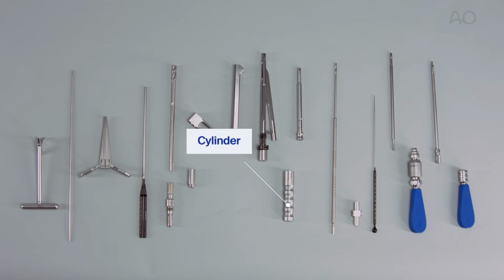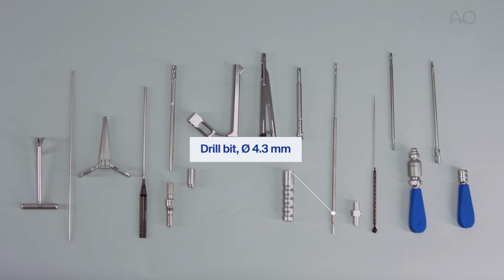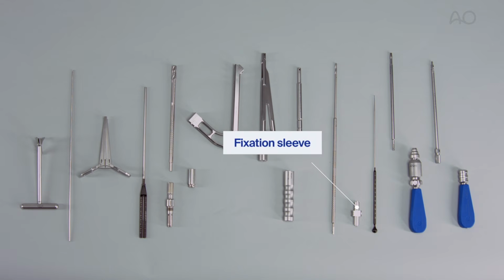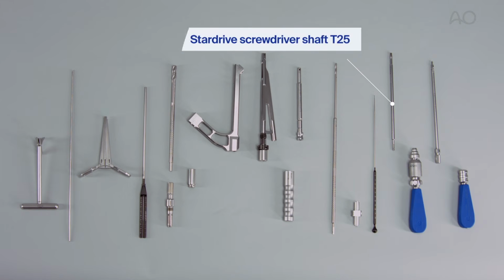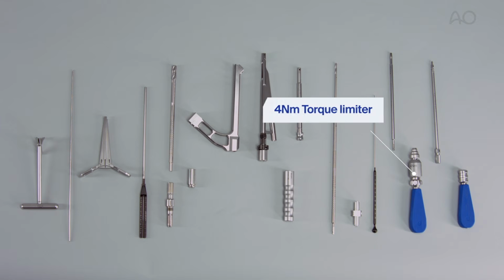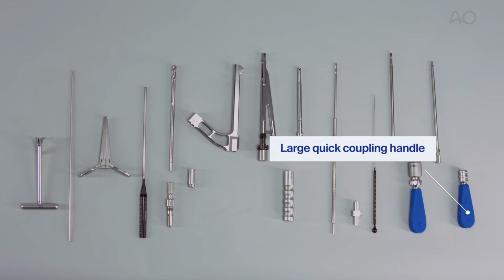the cylinder which is used for implant insertion and removal, the protection sleeve, which is used to both drill a hole and for the insertion of the 5.0 locking screw on the femur shaft, the drill bit, diameter 4.3 mm, the fixation sleeve, which, when assembled with the drill bit 4.3, is used to drill for the anti-rotation screw, the depth gauge, the star drive screwdriver shaft T25, the 4 Nm torque limiter attached to the large cannulated handle, the multifunction rod, which is used for both intraoperative compression and implant removal, and the large quick coupling handle.